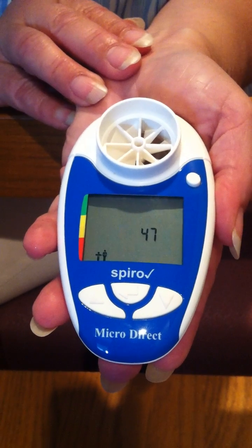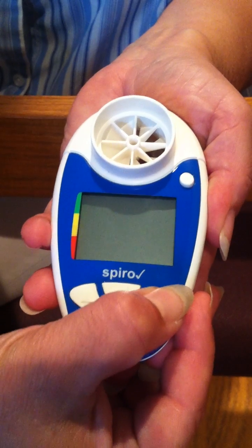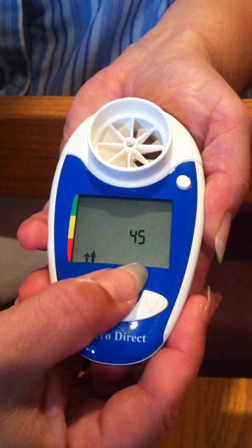Now we enter the person's age by pressing the up or down arrow key, and when the correct age is displayed, press the enter key.